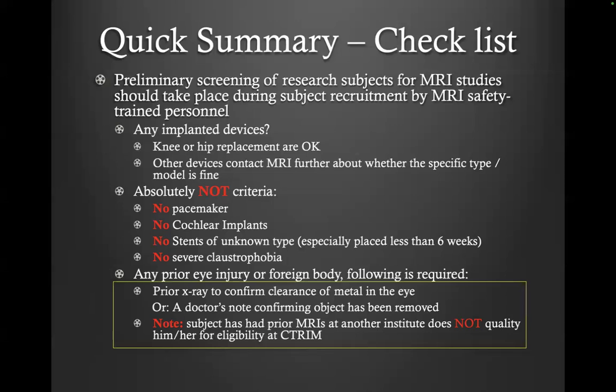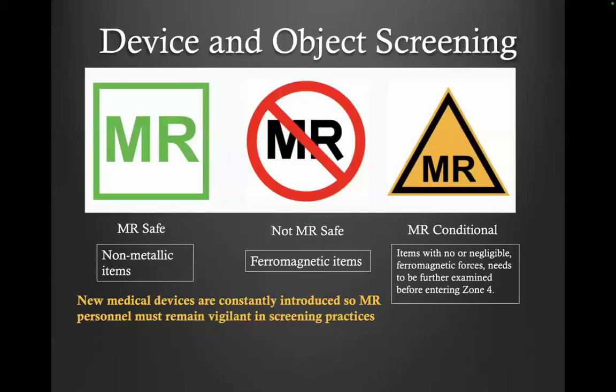So this I want to highlight because we've literally turned away subjects because of this. One more thing: circle contact lenses, these color contact lenses, are not MRI safe. Ask the person to remove them before they come.